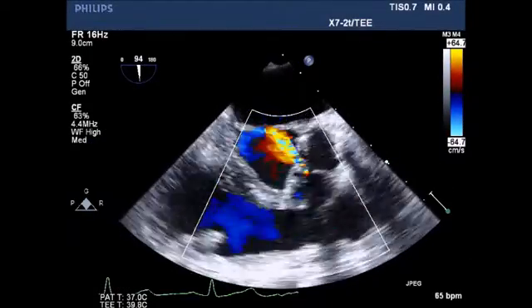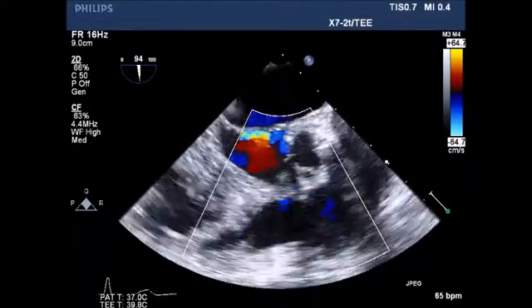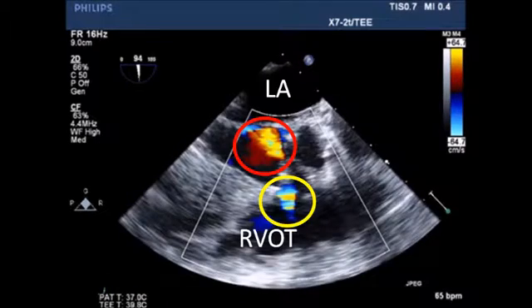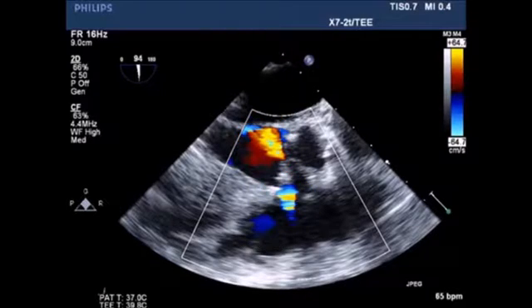View of the aortic valve and subaortic valve area, demonstrating color Doppler of the right ventricular outflow tract, as well as the aortic insufficiency in red.